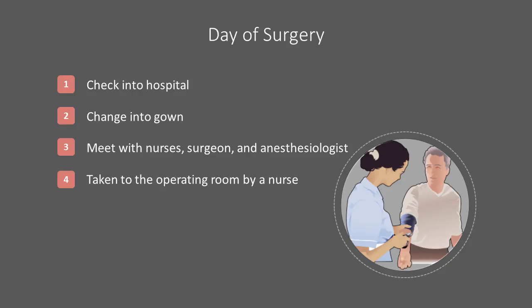On the day of surgery, you will be checked into the hospital and asked to change into a hospital gown. Your doctor and the anesthesiologist will meet with you, and then you will be taken to the operating room by a nurse or assistant.